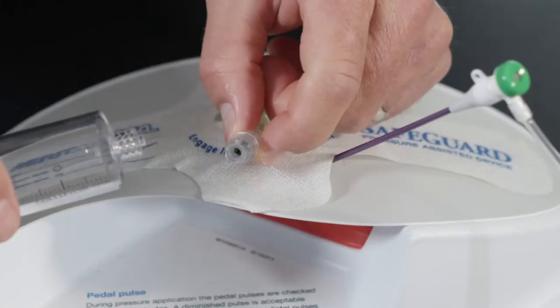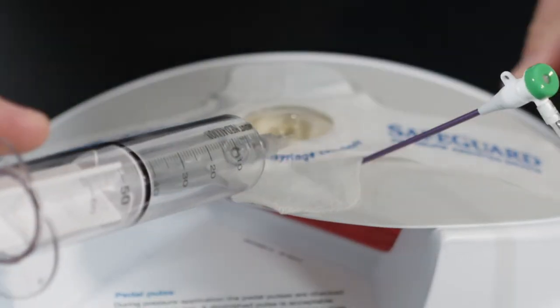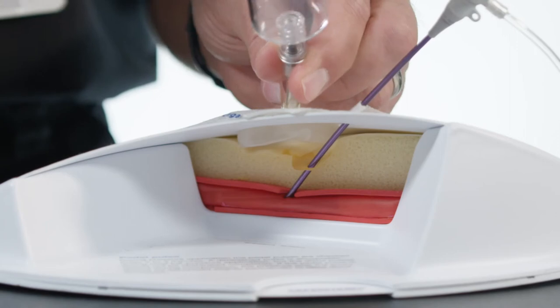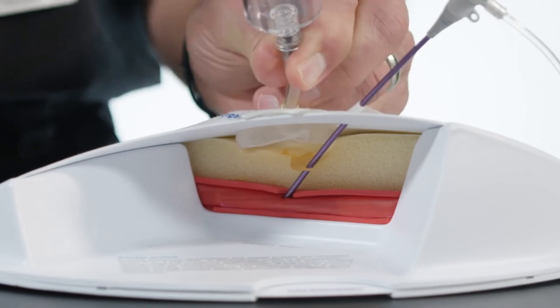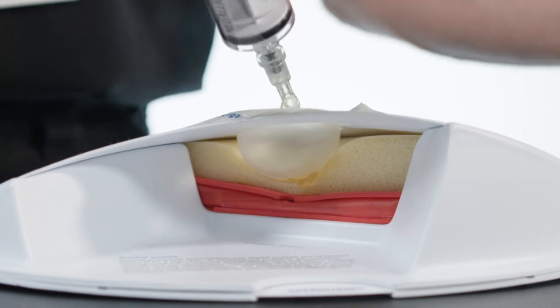Now pull one strap down, expose the adhesive to the skin, and apply, then do the same with the other side. Ensure that the band is snug and tight against the skin and the balloon remains over the arteriotomy. Engage the inflation tube with a luer locking syringe. Inflate up to the maximum volume of 40 ml of air into the bulb to apply pressure on the arteriotomy site, and simultaneously pull the sheath out as you inflate the balloon.